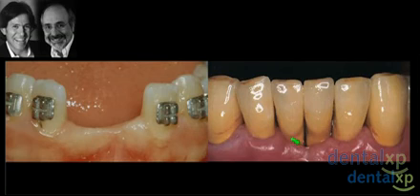The implants are very close together, the tissue, the ability for us to cleanse this area, and then the fact that with a little bit of bone between the implants has a higher risk of further bone loss would be something that I would be concerned about. So it's a potentially vulnerable area all over again.